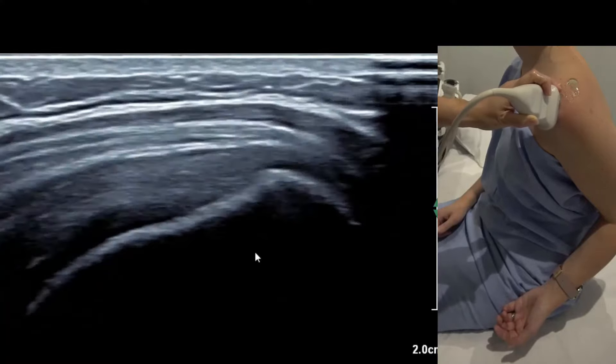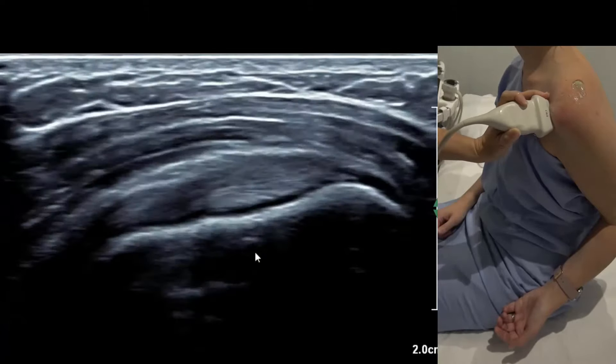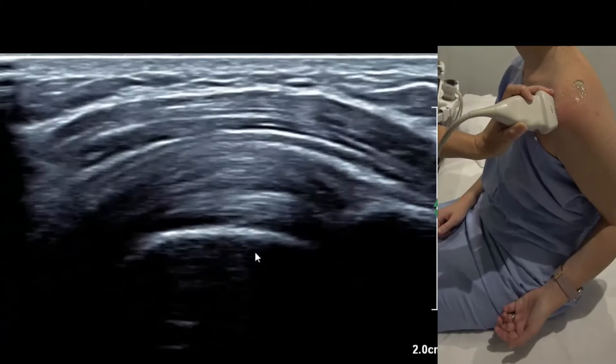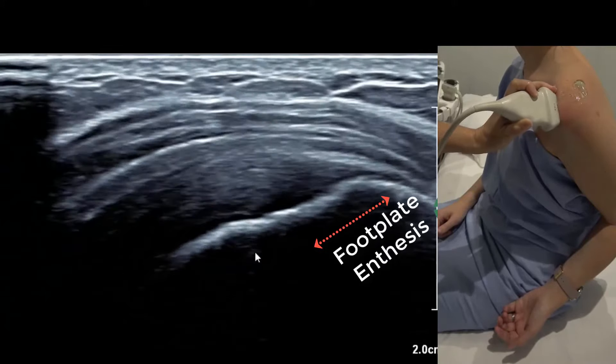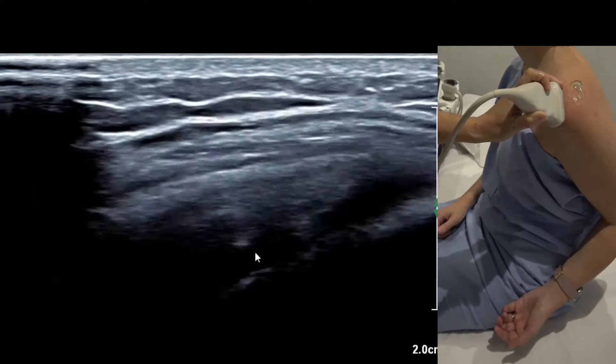Lining up on the biceps only works for the supraspinatus longitudinal view. Here's the rainbow again — move back: supraspinatus anterior, mid, posterior, and then too far and that's infraspinatus.